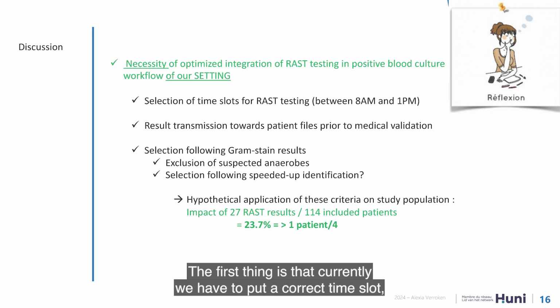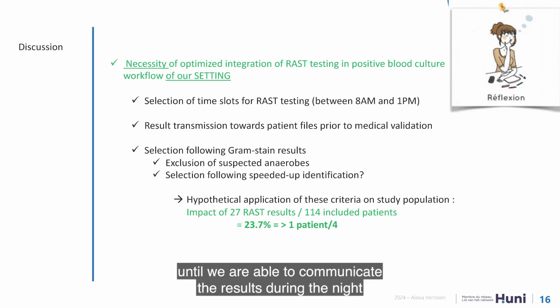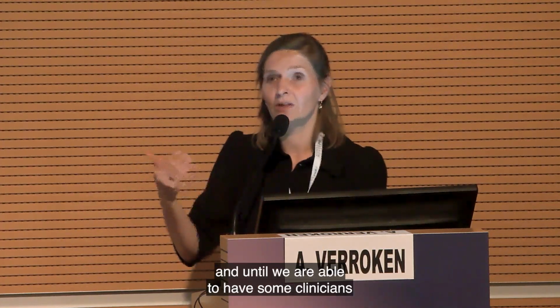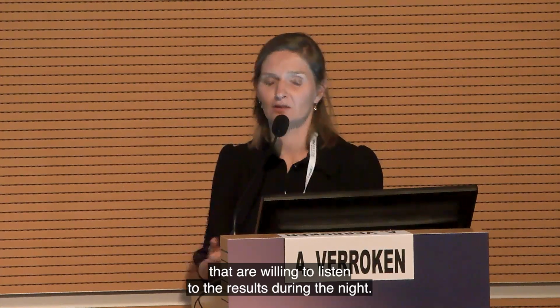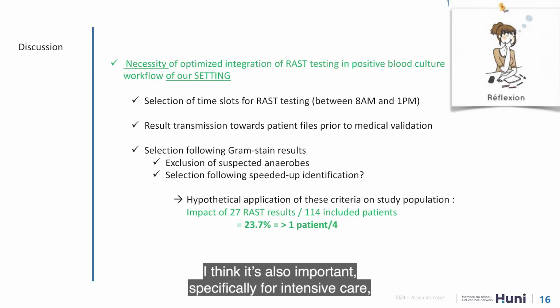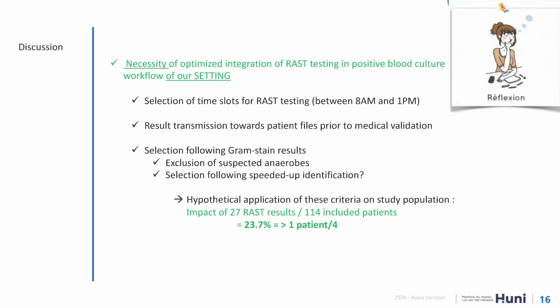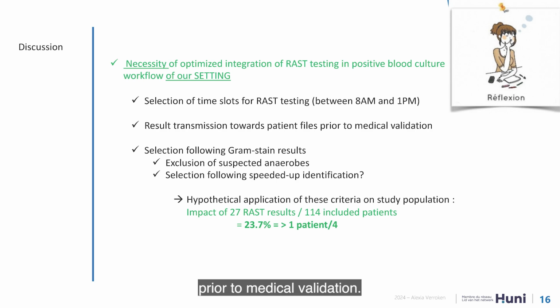A first thing is currently we have to put a correct time slot, a useful time slot for rapid AST testing, which in our lab is during the morning, until we are able to communicate the results during the night and until we have some clinicians that are willing to listen to the results during the night. I think it's also important, and specifically for intensive care, who is awake 24 hours out of 24, to enable a result transmission towards the patient's file prior to medical validation.